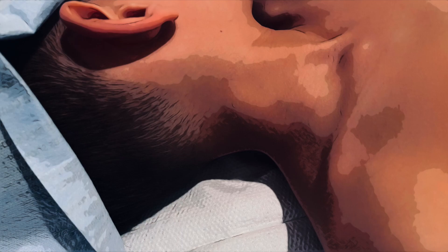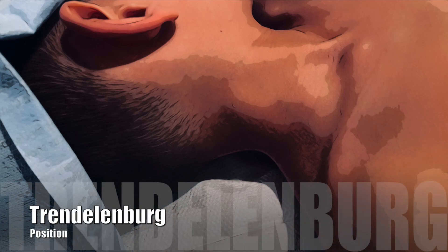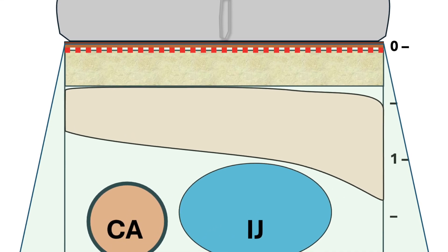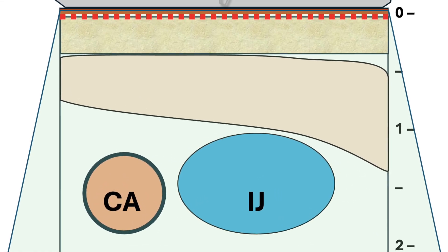Before setting up, I position the patient in Trendelenburg with the face turned away from the access side, if they can tolerate it. With ultrasound, I assess the IJ — the internal jugular vein — for its depth, size, and compressibility in relation to the carotid artery.